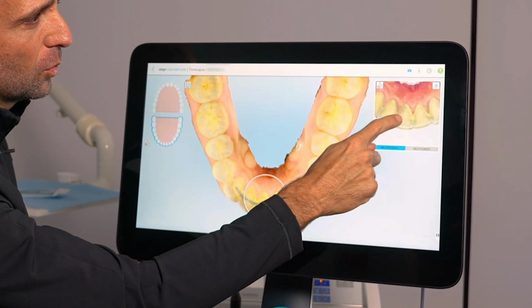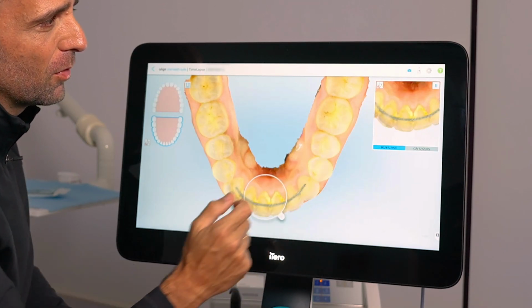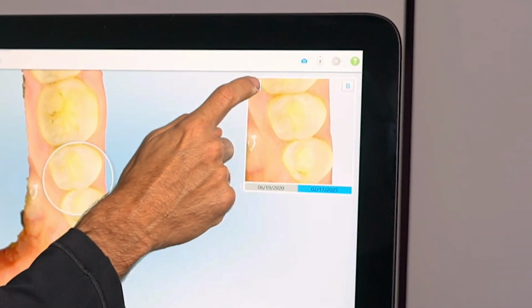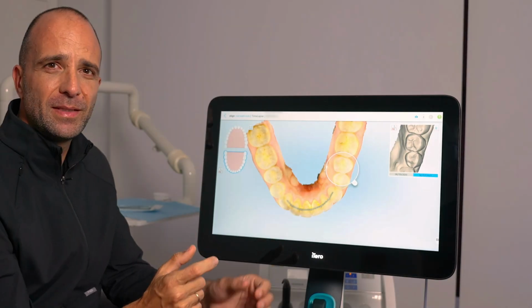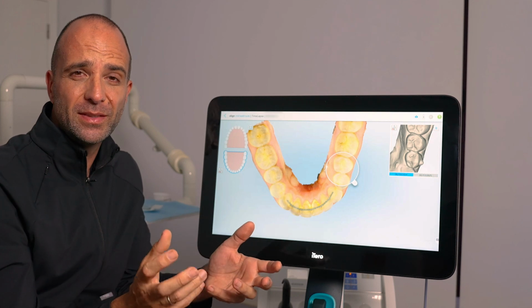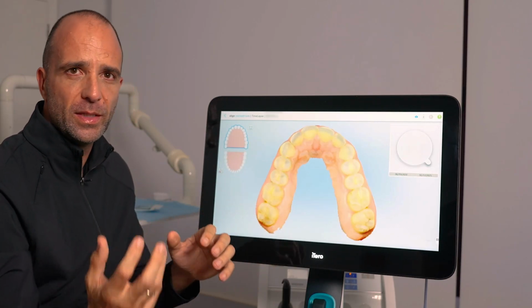If we check, the patient was not wearing retainers, and now with the retainer, because we are doing some ortho in 2020, has a little bit more plaque. On the other part also, we can take the color out and see how aligners were helping to move the patient's teeth, and we see some of the attachments. So this time-lapse feature is very helpful to have all the information of the patients, and that's why we are scanning every patient in every visit, so we can compare, having this loop, lower and upper part, in all of our cases.